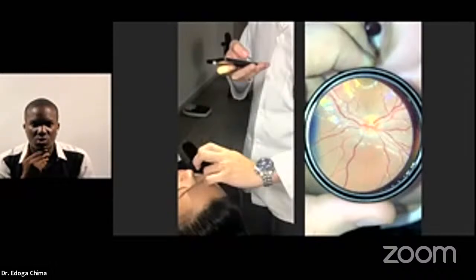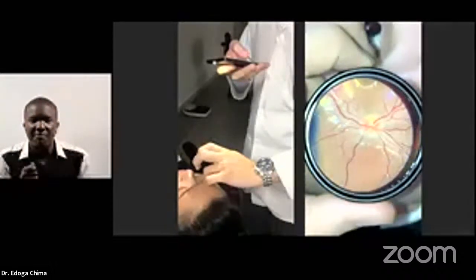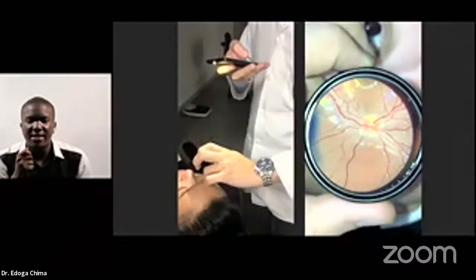Take for instance, if I want to examine the right eye of a patient and I'm at the head of the patient, what I'll be seeing in my camera will be the optic disc by the right side of the camera screen, and the macula will be by the lower left side of the optic disc, just as if I am viewing the eye using a direct ophthalmoscope. So that is one of the advantages.